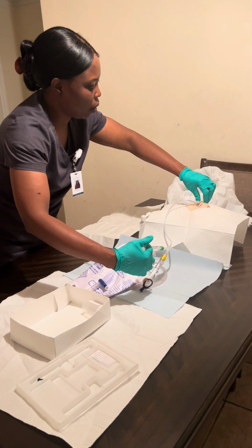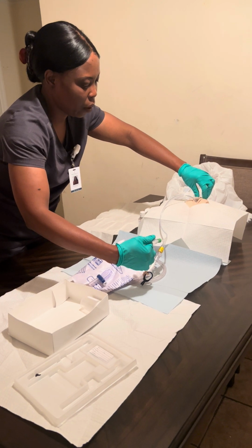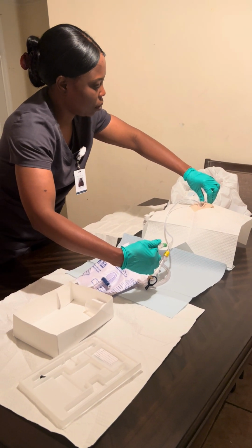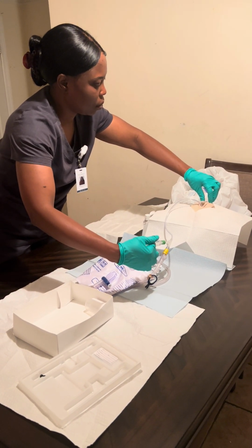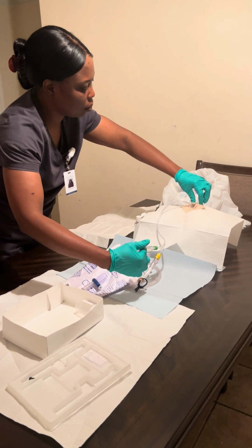Okay, Mrs. Smith, I injected my 10 cc of fluid. I'm gonna make sure the tube is secure. Okay, Mrs. Smith, you're almost done.